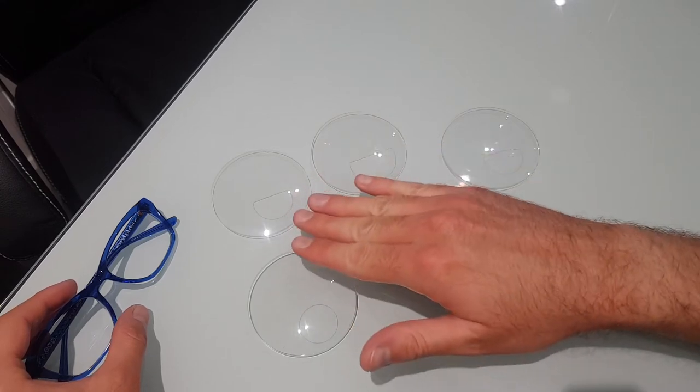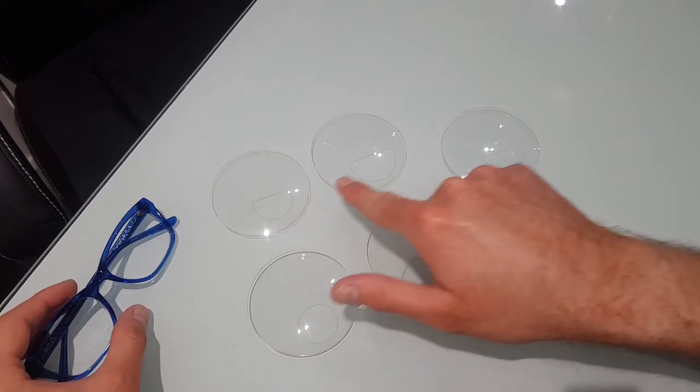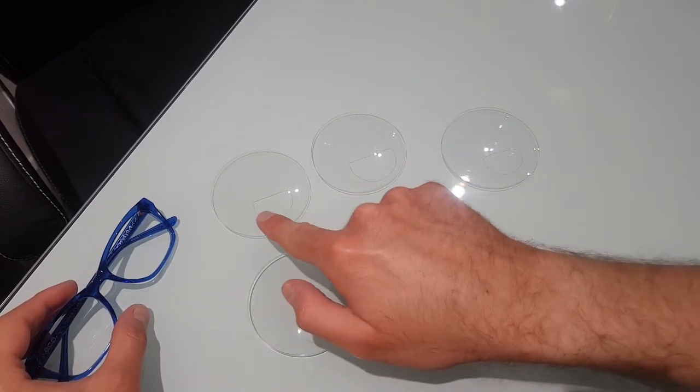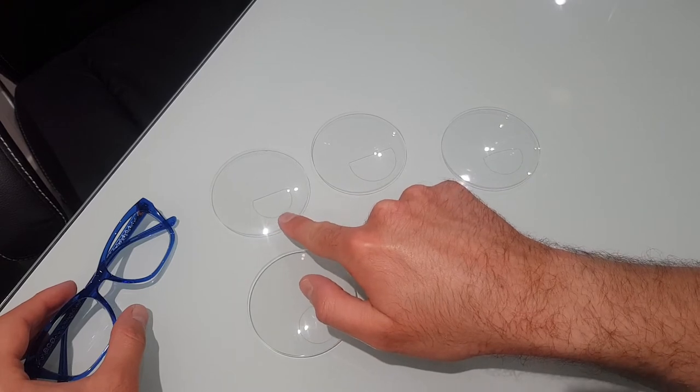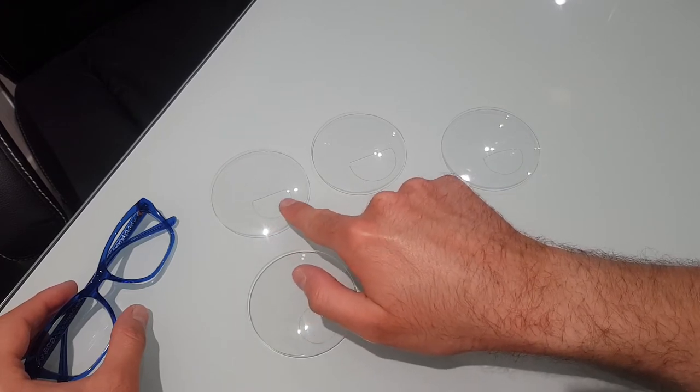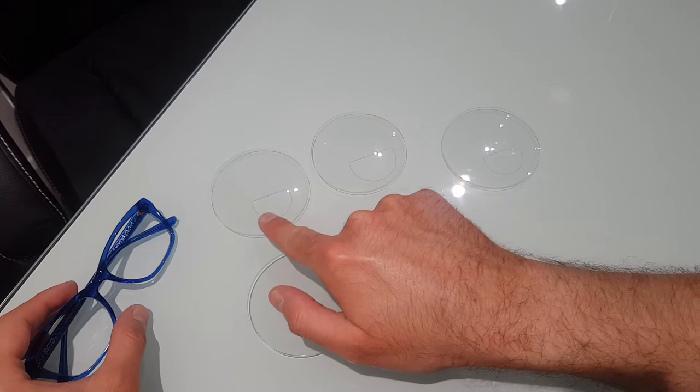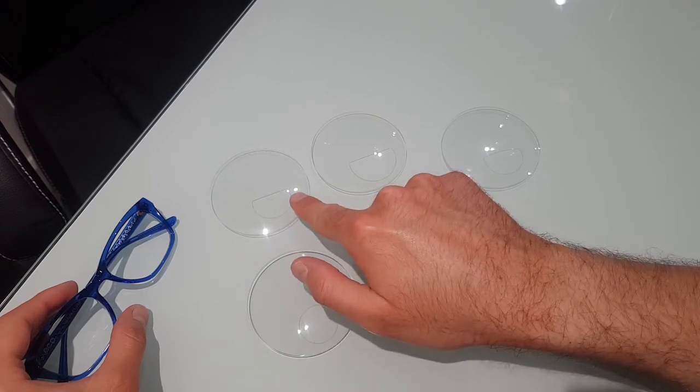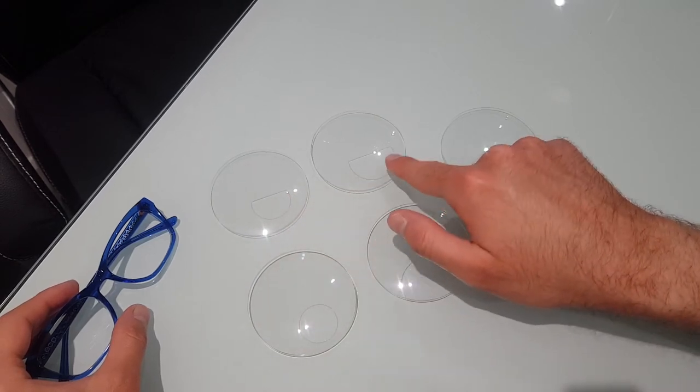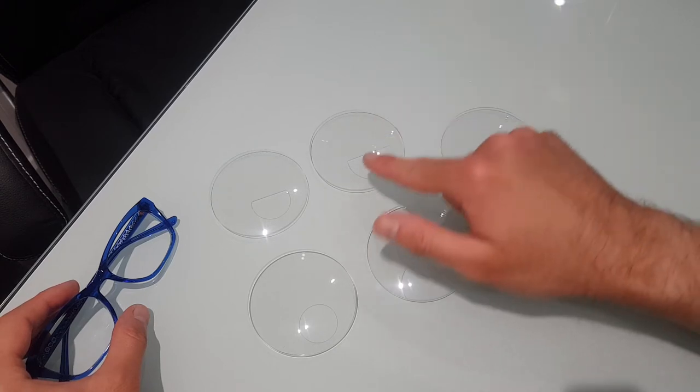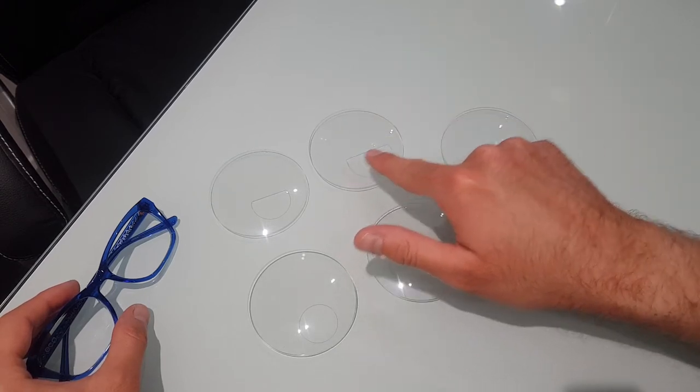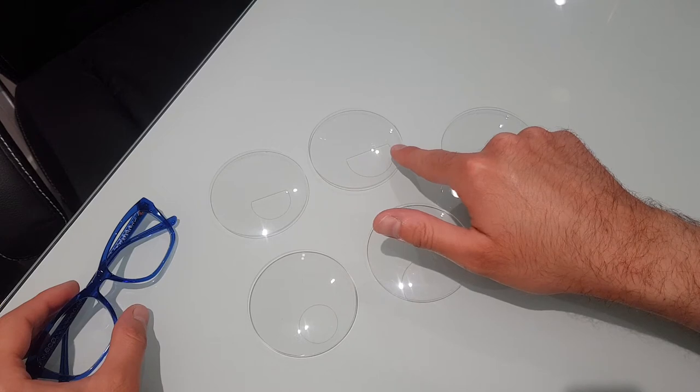When we're looking at the DSEGs, the only difference is the size and the width of the segment. So this one here is called a D28, which means it's a DSEG and the top of the segment is 28 millimeters across the top. The next one is a D35, and that means it's 35 millimeters from edge to edge.